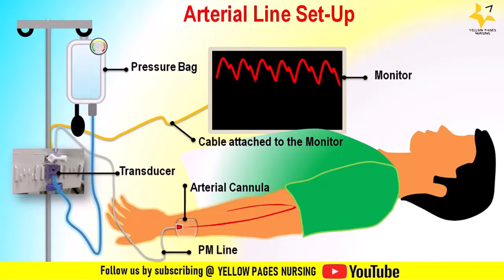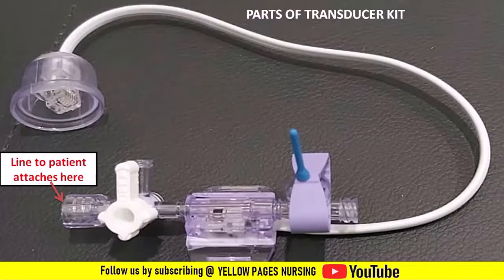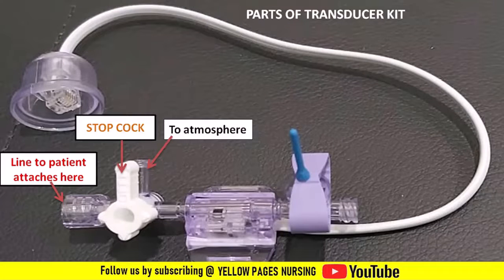Now, parts of the transducer kit. This is the point where the arterial line is attached with the help of the pressure monitoring line. Next comes the stopcock. When we take a close look at the stopcock, there is a word written on it, off. When we look at the direction in which it is turned, it indicates that the stopcock is off to the atmospheric vent, and this means that the arterial line is open to the transducer.